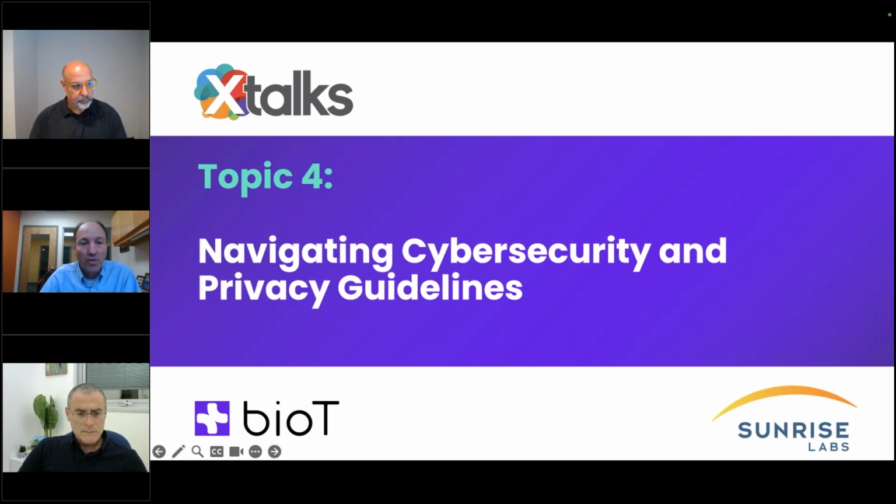So if you add these things that are going to potentially affect safety and efficacy, they become part of the medical device. So one of the ways that we architect the system to try to reduce those interdependencies is we will take the performance, safety and efficacy related part, like say the therapeutic part of it, and we'll put that in something that's maybe a class C or class B kind of processor, and we'll isolate them from the user interface and the connectivity portion of it.